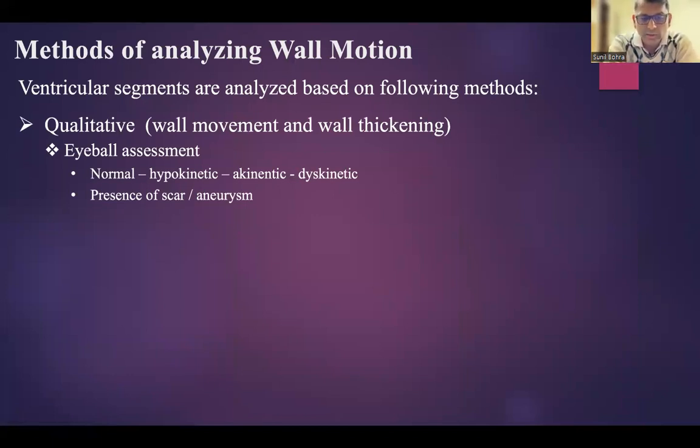So here, I'm sure all of us are doing this, but I would not recommend this to be the sole method of assessment and describing the segments, especially for a person who is starting to do echo or who is not very experienced. The eyeball assessment improves with experience.